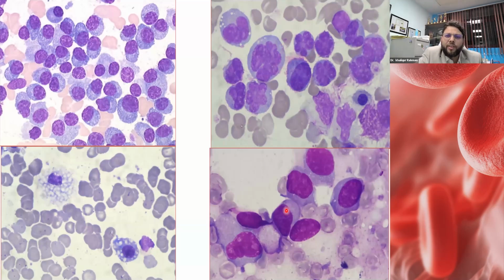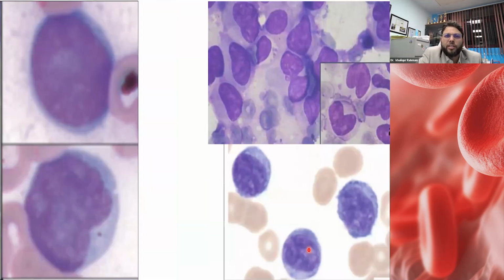We can have plasma cells with immature lymphoid-looking morphology, sometimes mislabeled as acute leukemia. We had one case of oval to spindle-looking cells, a spindle cell myeloma. You can have a small cell myeloma, which is usually positive for cyclin D1 and t(11;14) translocation.